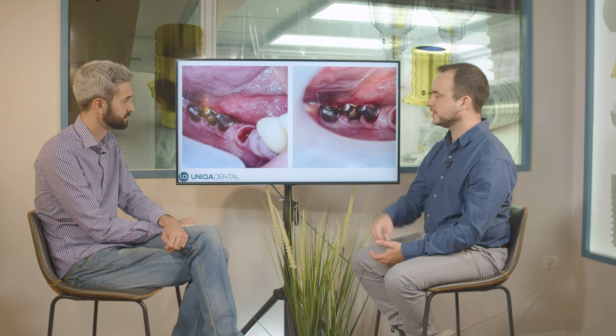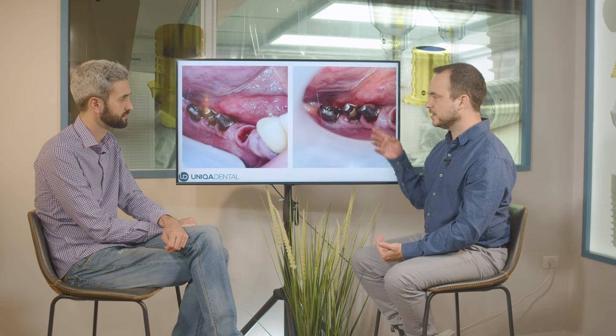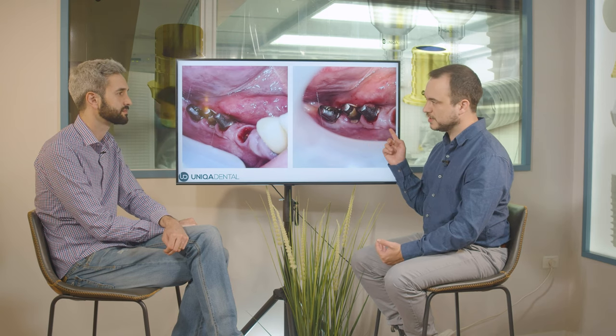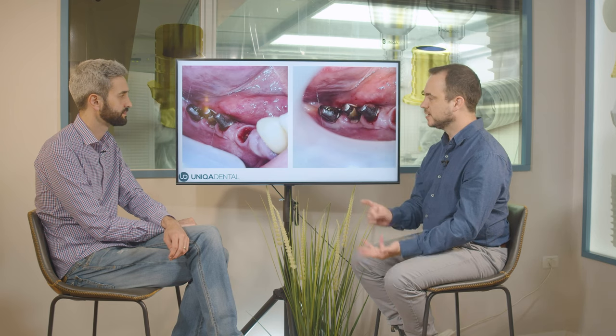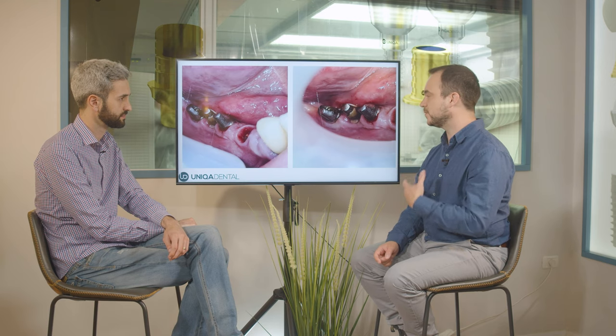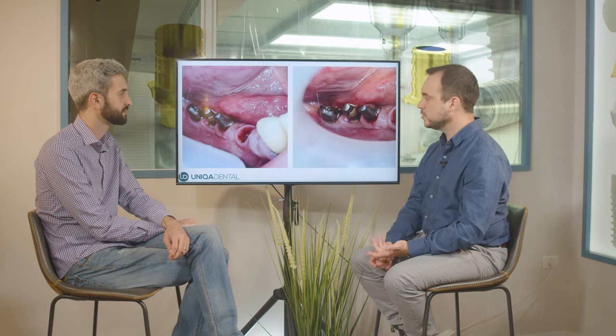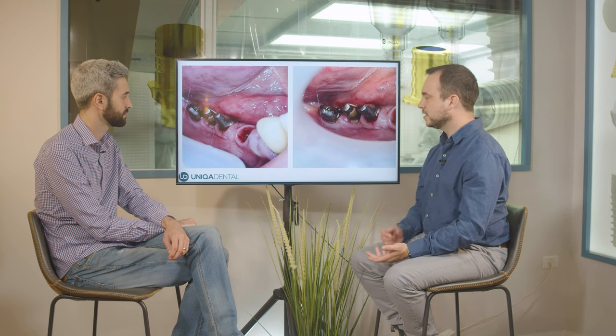In this area it's very problematic to see the cement, because when you take an x-ray of the implants, you don't see the cement in the buccal and palatal area — you see only in the proximal areas because of the angle of the x-ray. So this cement, you can see with your own eyes or with the x-ray, but you don't always know if there was any problem. You can see it right now when you take out the bridge. You know there were residues of cement, a little bit of plaque, and there was inflammation.